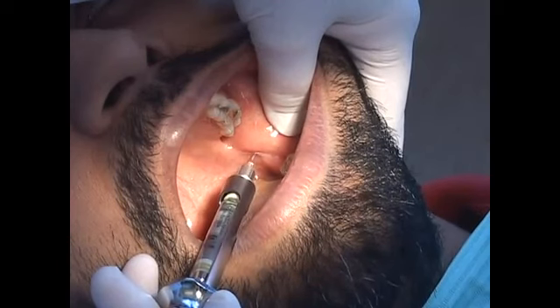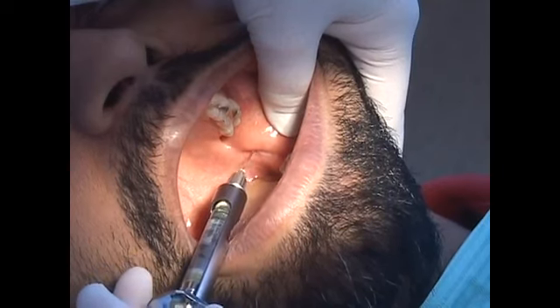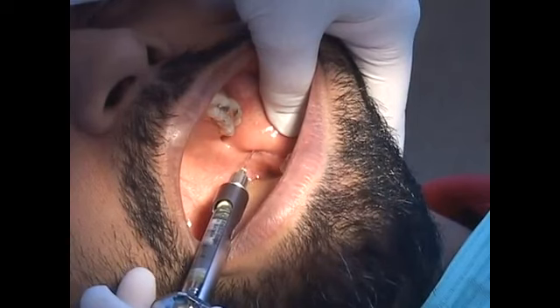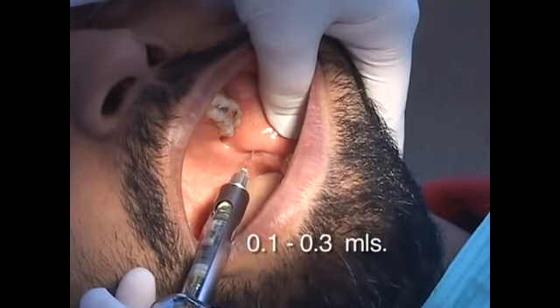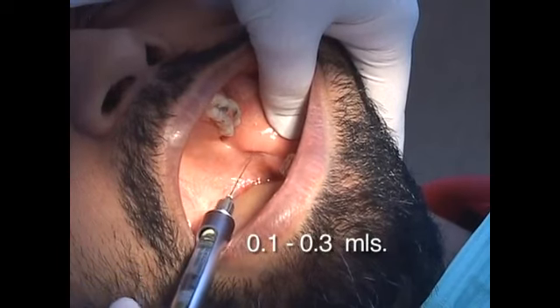The lingual nerve can be easily anesthetized at the same time as the inferior alveolar nerve. After depositing the anesthetic for the inferior alveolar nerve block, withdraw the needle approximately half its length, perform aspiration, and deposit a small volume, approximately 0.1 to 0.3 milliliters of anesthetic solution.